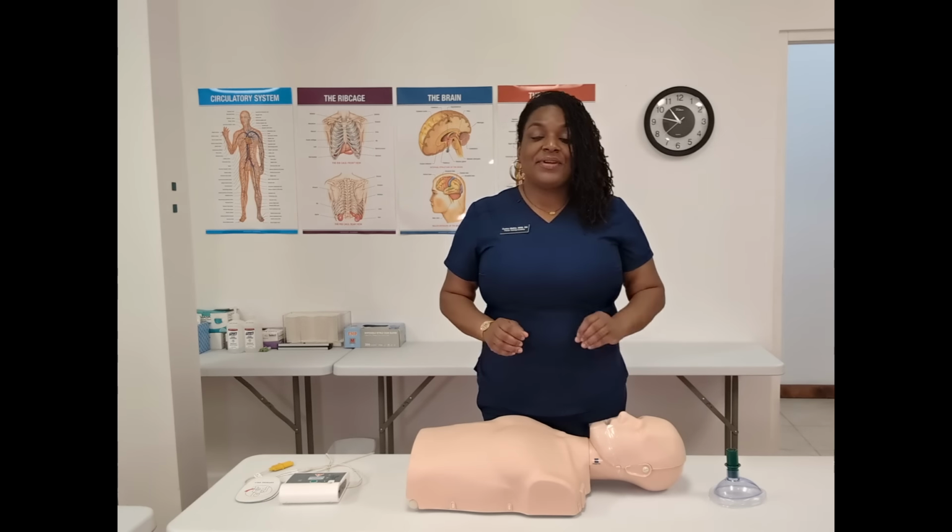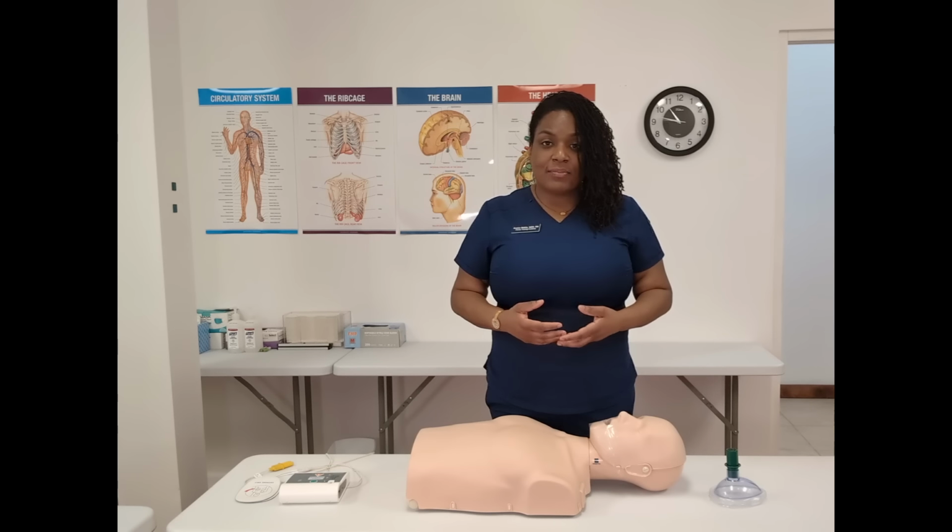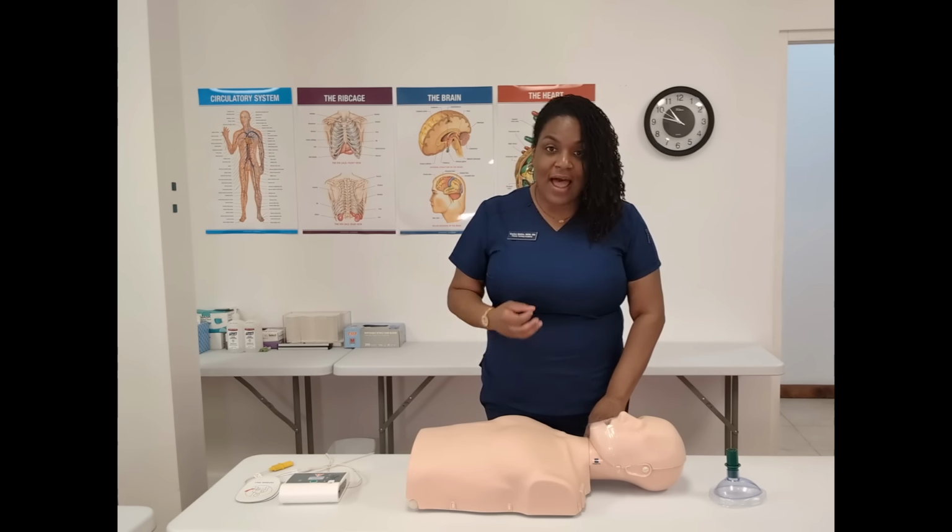There's a breath that's called an agonal breath. It's more like a gasp. If there are no signs of life and the person lets out air, you are to assume that this person's in cardiac arrest because an agonal breath is a precursor to cardiac arrest. And so now one's on the phone, I'm telling them that there's no breathing, there's no pulse. They're gonna ask, do I have an AED? And in our case, we have our trainer here, so yes, we have an AED.